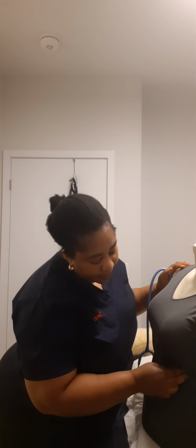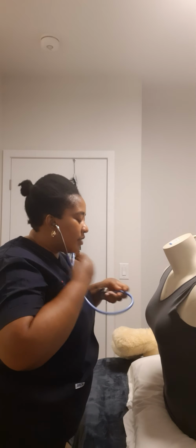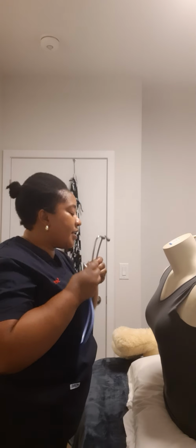And then the other one is on the left second intercostal space, which is called the pulmonary valve. Then the next one is on the lower side of the left intercostal space, which is called the tricuspid valve. And the last one is still on the left side beneath the breast, which is called the mitral valve. And then on these valves, I'm going to be auscultating for the S1 and the S2 sound.